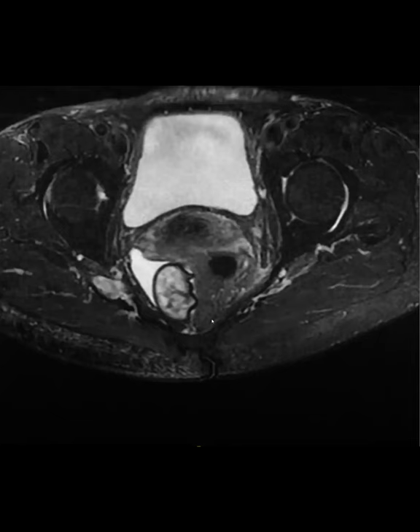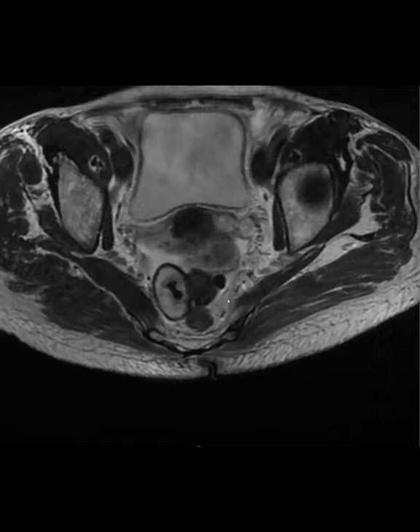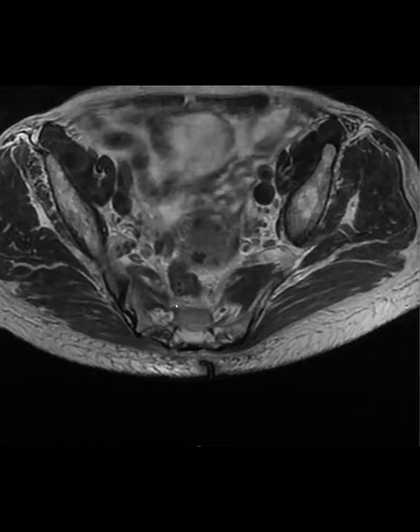So it looks like it's a bilobed mass, and one part of it is T2 bright, and the more central part is T2 dark. And then just to show you again, I think this mass is totally separated from the uterus. Yeah, so that was my other thought, could it be a really weird looking pedunculated fibroid? Can you show the sagittal? Sure. And the ovaries are totally separate from this area.